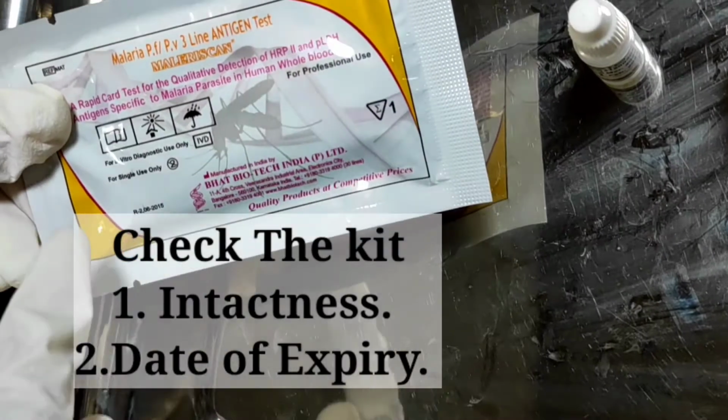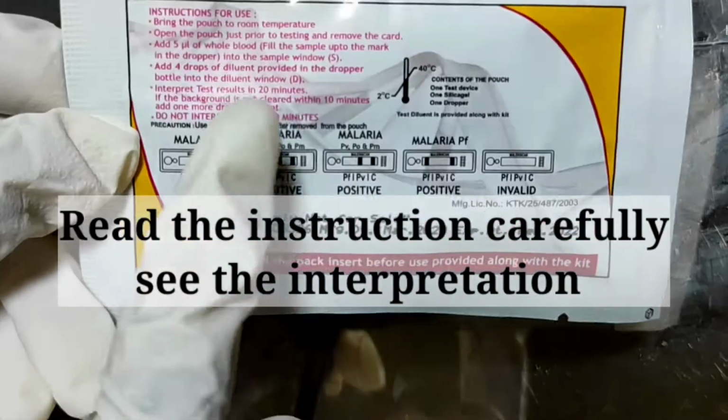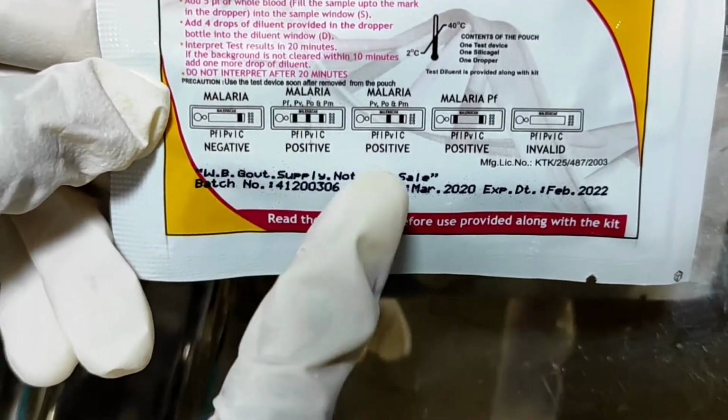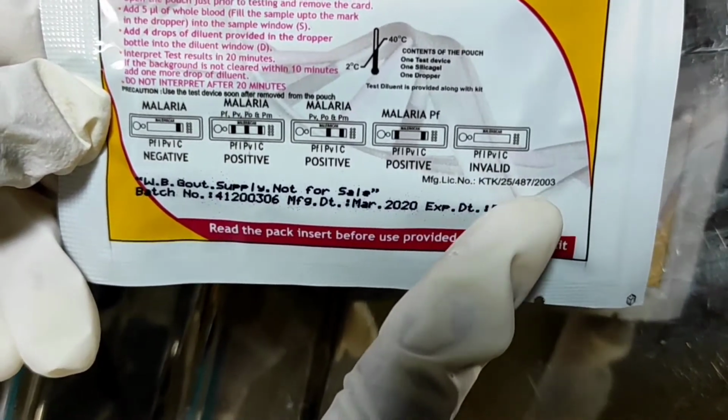Check the kit for intactness, date of expiry, and obviously the general instructions. Read properly and see the interpretation. In the interpretation, there are 4 or 5 squares present, so read it carefully.